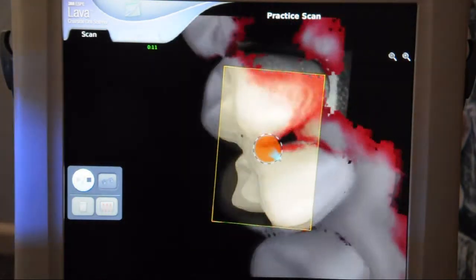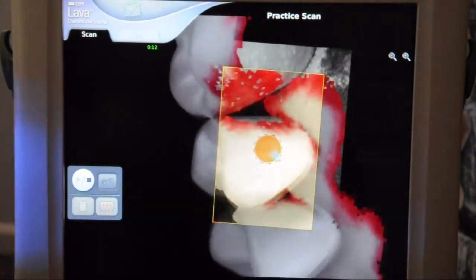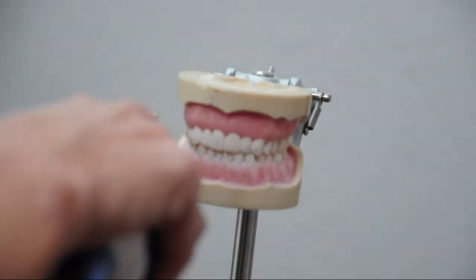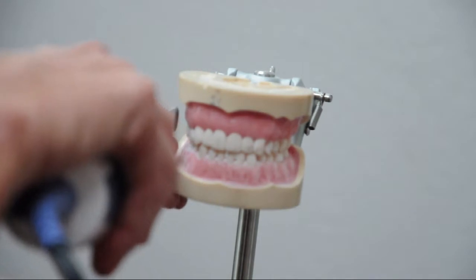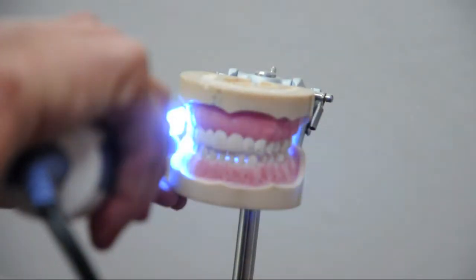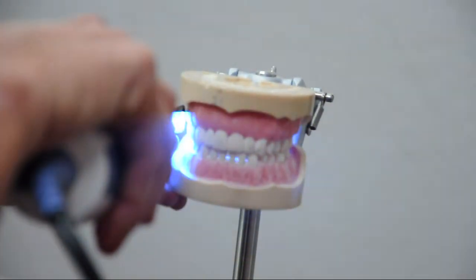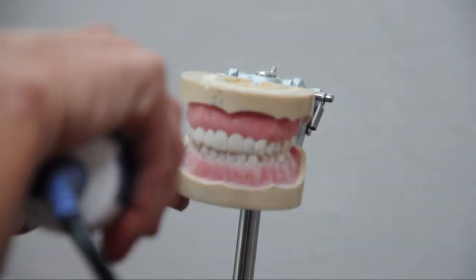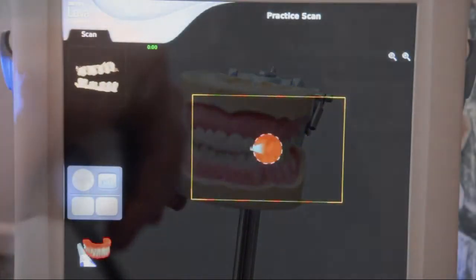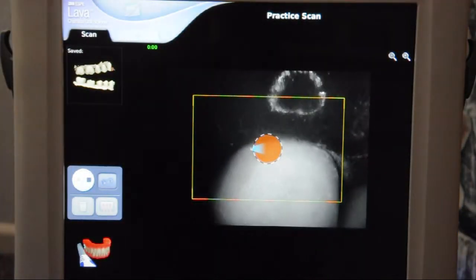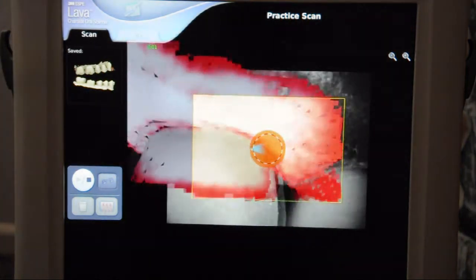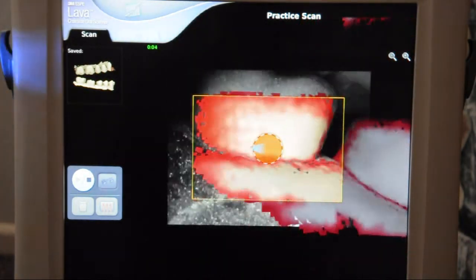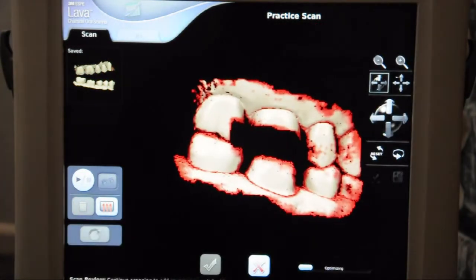We completed that in about 23 seconds. In both arches, we'll have our patient bite into occlusion and take a quick scan of the buccal, just at the gingival aspect, creating a little box here. And that information will be calculated by the computer to articulate.